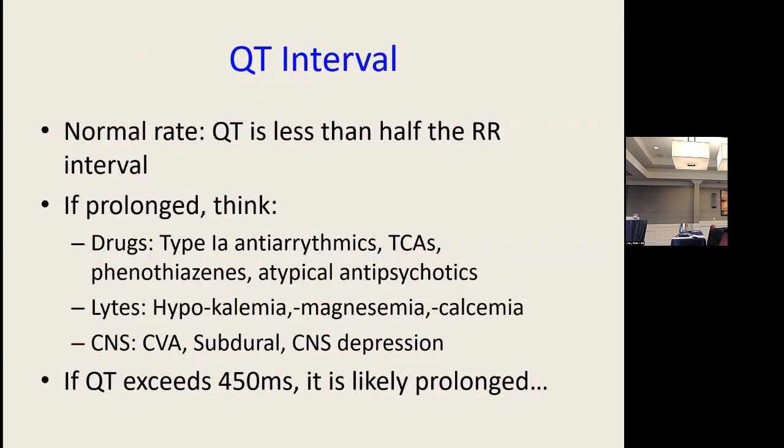So this is a nice rule to remember for QT prolongation. For those patients on phenothiazines, on type 1A antiarrhythmics, on antidepressants, and you're measuring QT, if you can remember this rule, you've got the ball game going. You could use corrected QT always, but this is a nice one to remember: half of the RR interval.